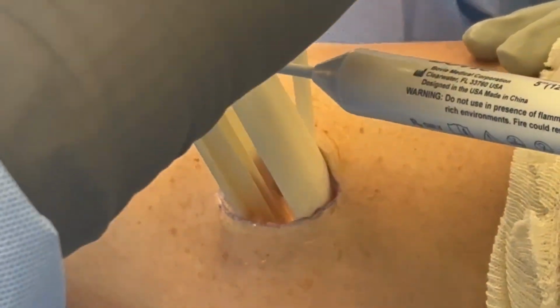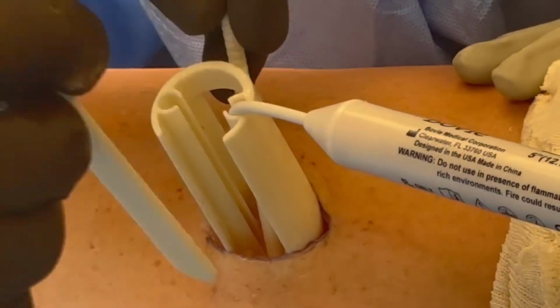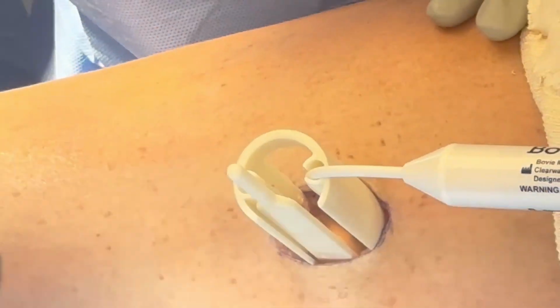Now I'm going to use an obturator to create a small channel beneath the fascial layer between the gastrocnemius muscle belly and the gastrocnemius fascial layer. And you can either come in from above or within the cannula. And if it's difficult to get this started, you can use a Metzenbaum scissors to create a little channel to get that underneath that fascial layer.